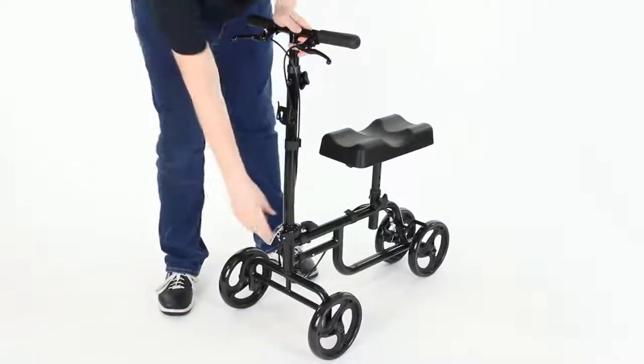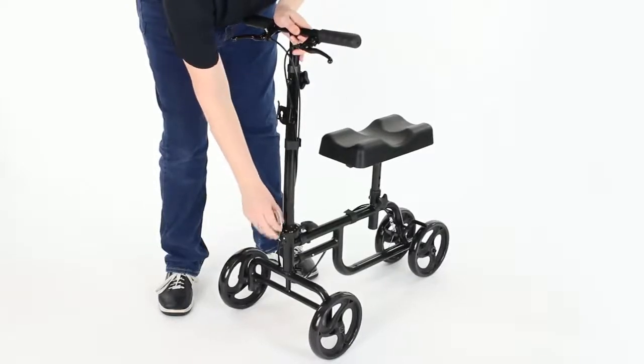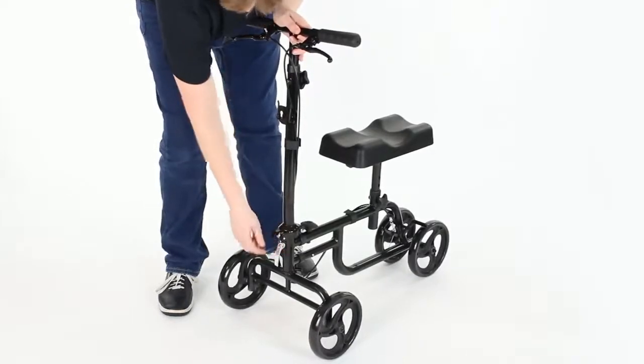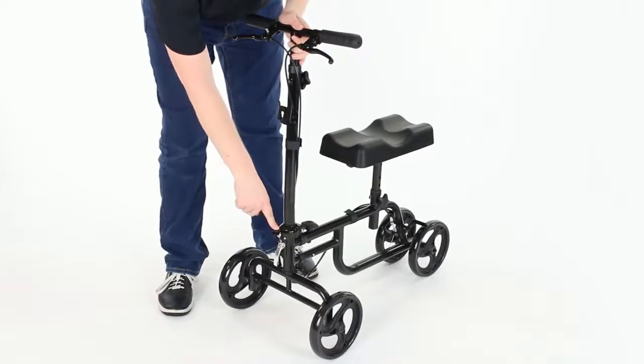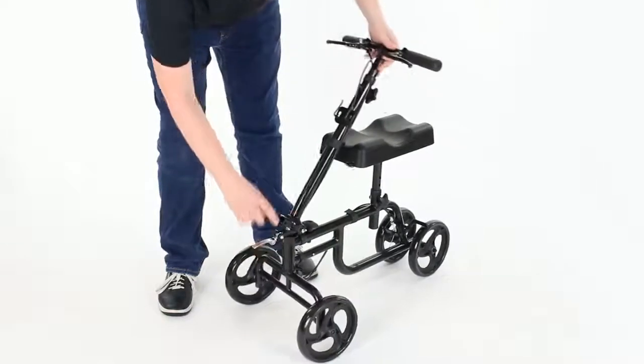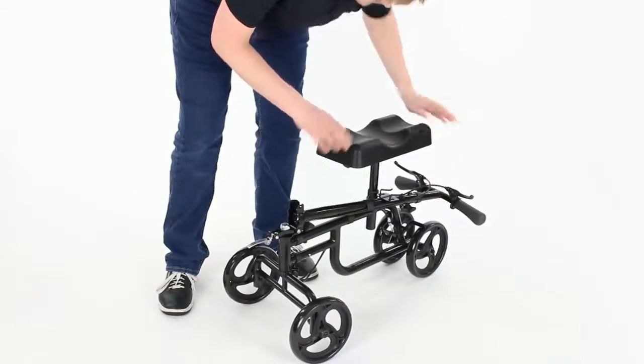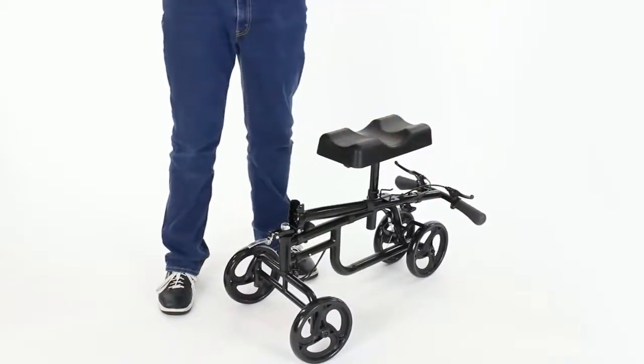To fold the knee walker, first disengage the tension lever at the tension lock and lower the tension lever assembly down to release the tension on the hinge. Then pull the locking pin aside to free the hinge and fold the handlebars under the seat. The seat can also be removed if you wish.